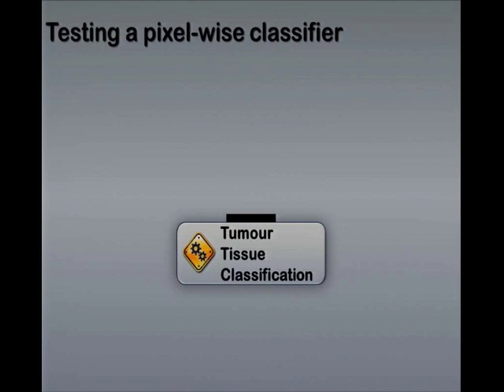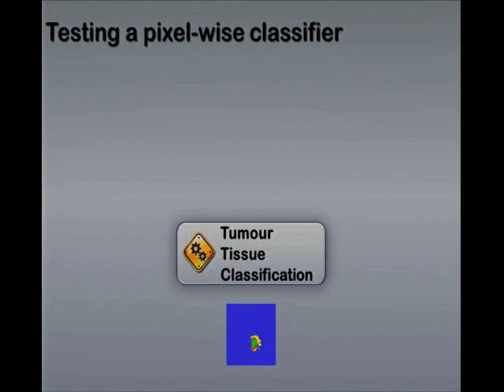So now I've got a new image coming for a new patient which the system has never seen before. So I push this into the engine, and some data is spat out that hopefully will correspond to the correct map for these 3 different tissue types. So that's the idea underlying all machine learning research, really. The key is really to design something which works, first of all, and is efficient enough to be able to do experiments with, and also to run in a short enough time in clinical practice.